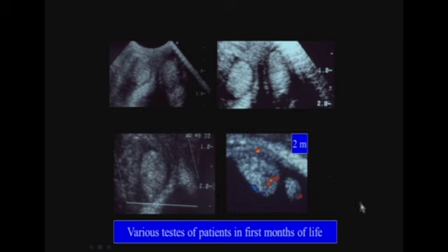Analyzing the color flow within the testicle of a very young child is somewhat more difficult than for an older child or someone with a larger testicle. The improved machinery we have today makes it a less daunting task than it was, for example, in the early 1990s. But one can see that the testes are intrascrotal on all these images, and they are homogeneous. This is just a view of one of the testicles.